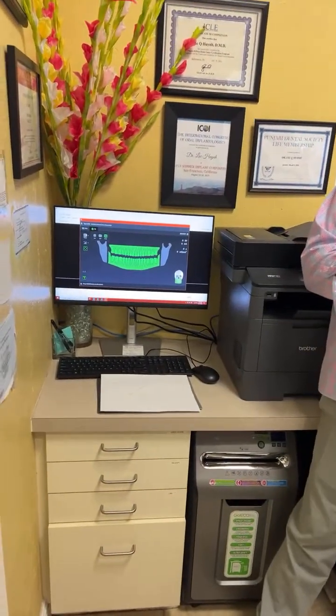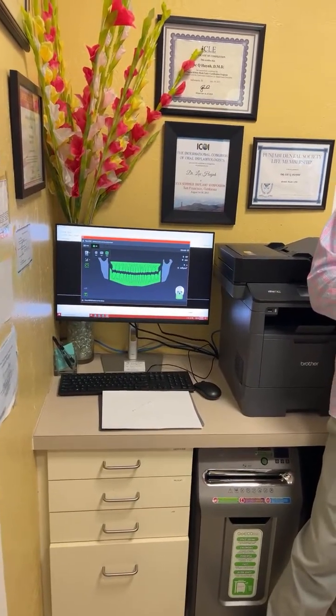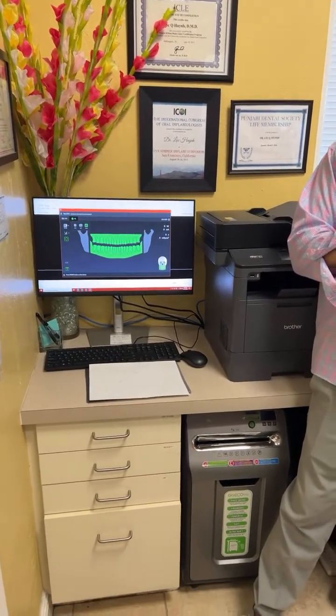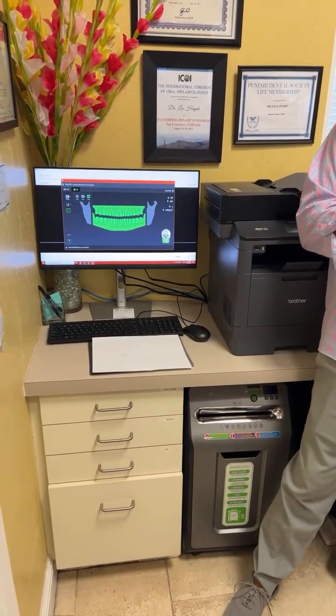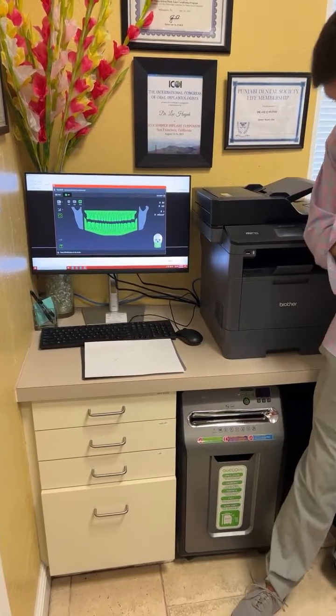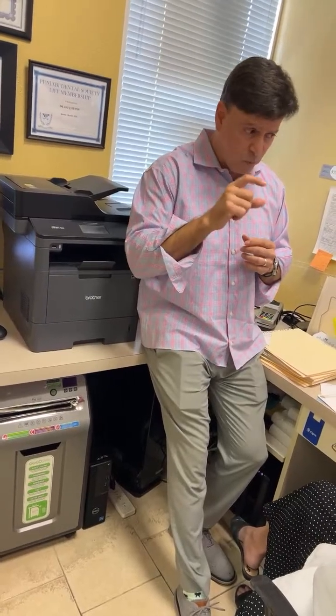So my question is, is there any option that, after we set up, we can review before we actually hit the button? Because we don't want the patient exposed many times. This is what you're going to tell them: we're going to do a scout shot first. It's very low dose. This allows us to be specific with what we want. We're only going to have to take this image on you one time, the full 3D.